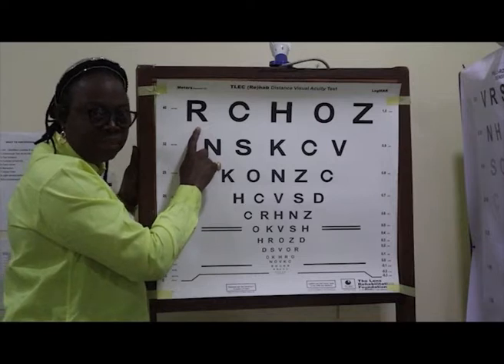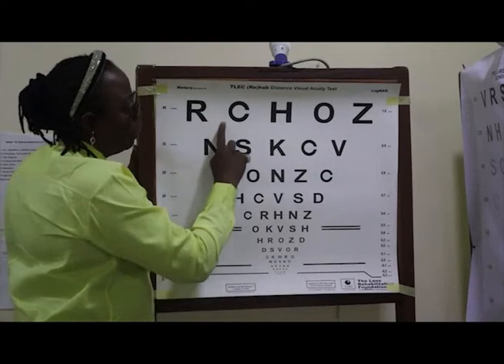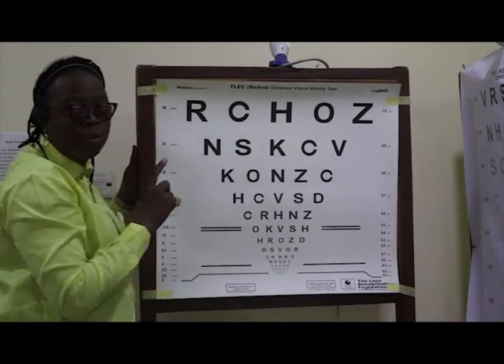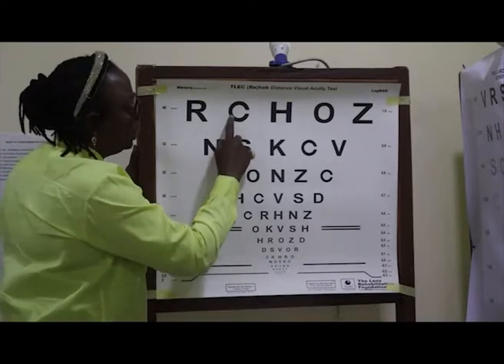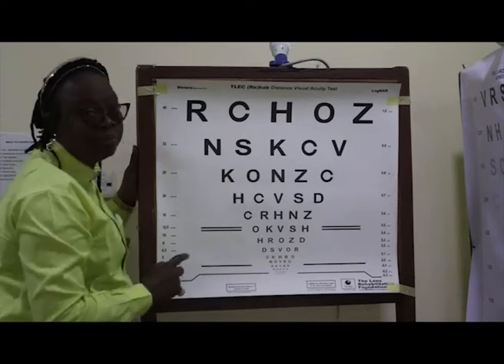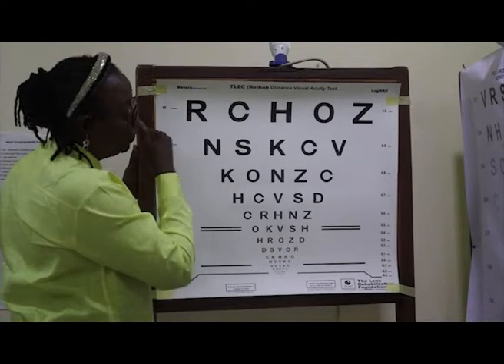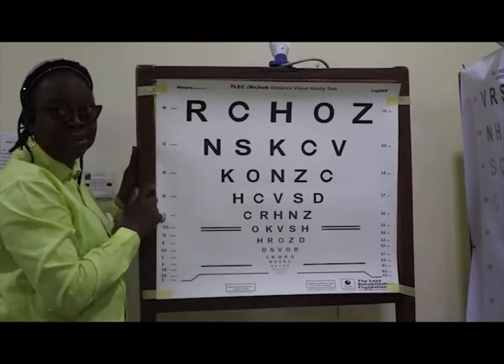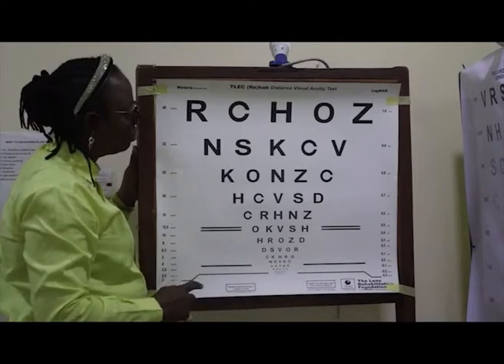When you look at the entire line, that means 1, 2, 3, 4, 5 times 0.02 makes 0.1 LOGMAR. So it changes by 0.1 all the way down to the bottom of the chart. The better the visual acuity that the patient has, the lower the figure that you have to record.